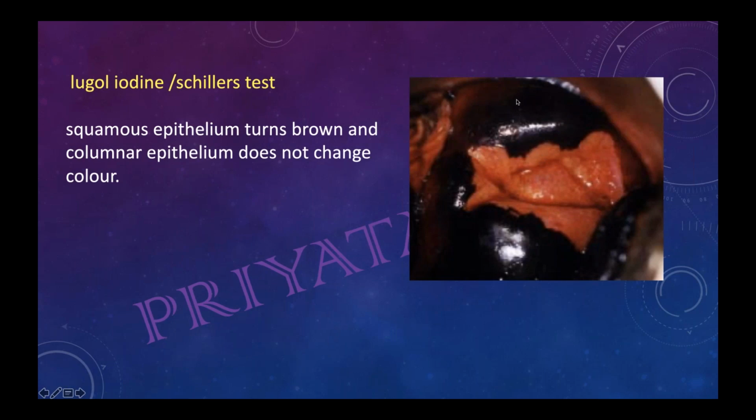But in the squamous cell area, if you find any area that has not taken any iodine, that is the iodine negative area.